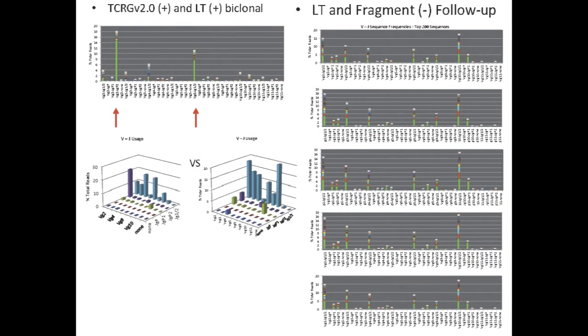So you can see here the many times that we did this same assay with that sample, and again, you can see that the reproducibility from run to run is very, very good, and then we cannot find those 2 clones anywhere in here. So the patient is free of disease based on that last sample that we got.